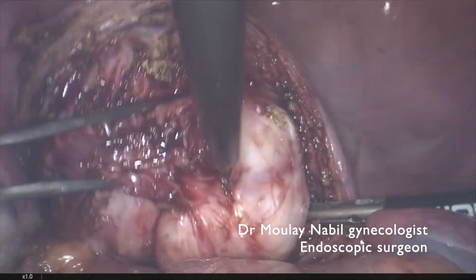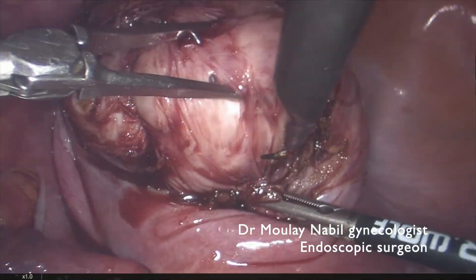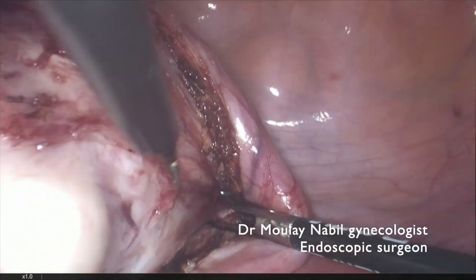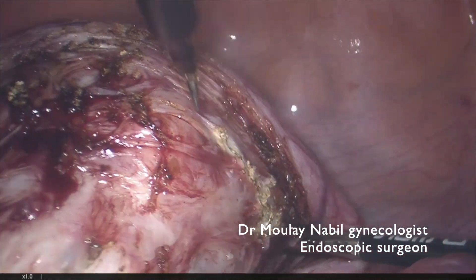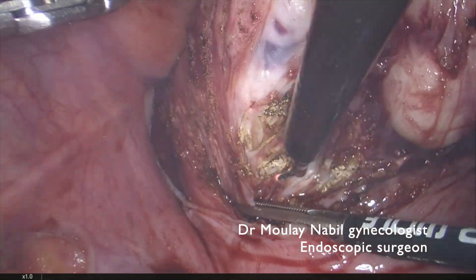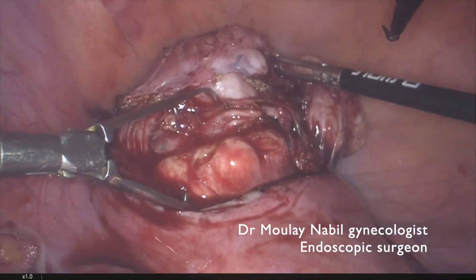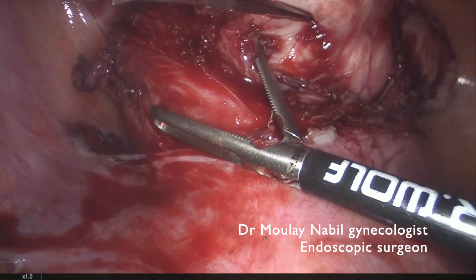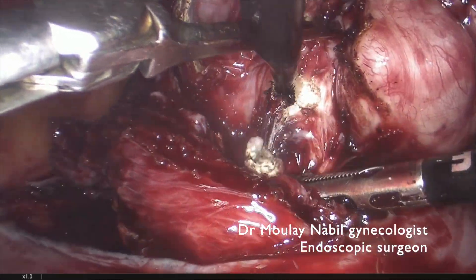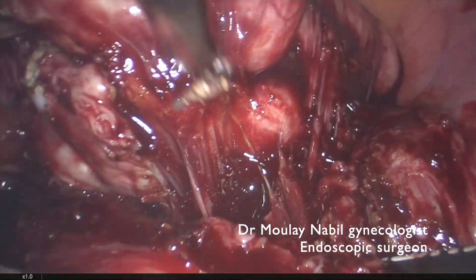We have to remove the myoma from its pseudo-capsule. When you find the good dissection plane, even for a cervical isthmic myoma, the dissection is quite bloodless, and you can see how the vascular control is useful for decreasing peroperative bleeding. It's important to detach the myoma progressively outside its bed by counter-traction on the myoma and traction on the healthy myometrium. Energy is applied only on the surrounding myoma tissue and never on the healthy myometrium.